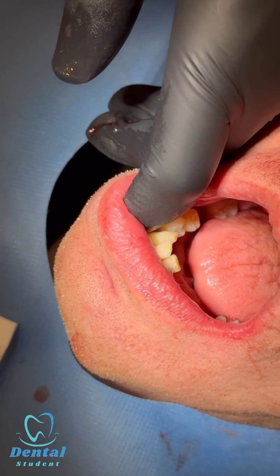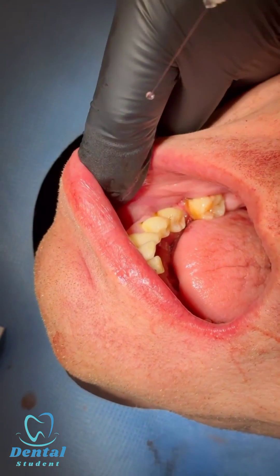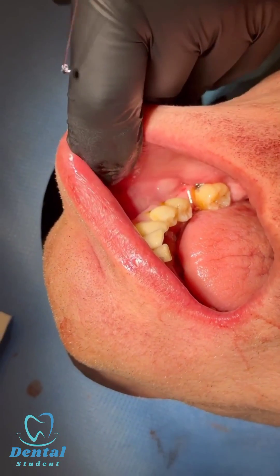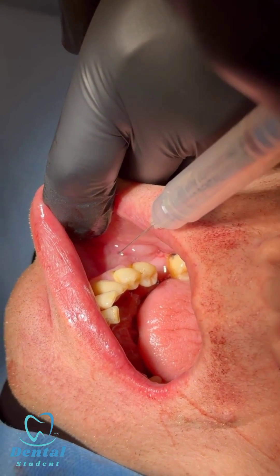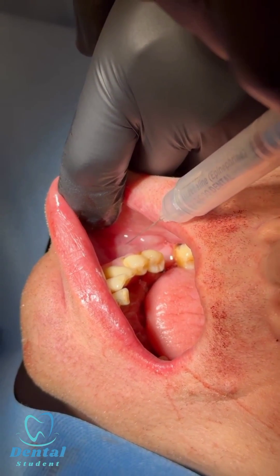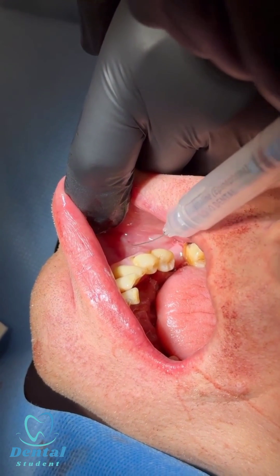Now I'm going to show you a mental nerve block. Pull the lip out of the way, go between four and five, and as you can see, the needle is parallel to the teeth. Introduce the needle gently.